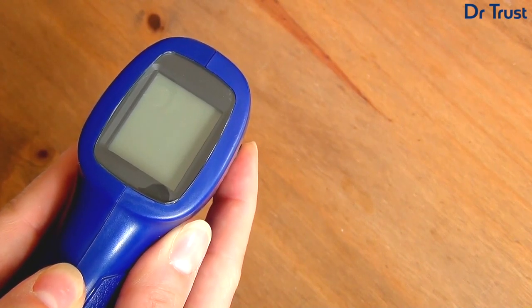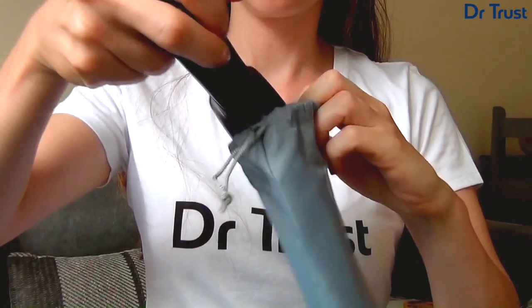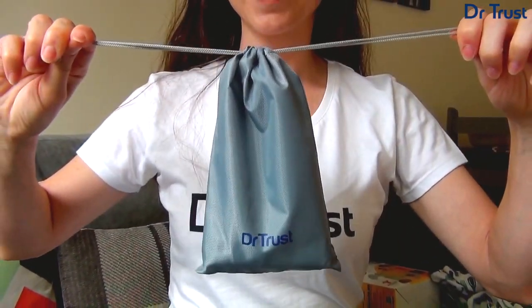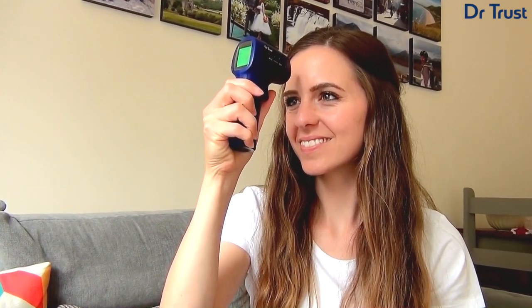Don't forget, the device will turn off automatically after 10 seconds to save energy. So don't fret about temperature tracking — make life easy with the Dr. Trust Non-Contact Infrared Thermometer Gun 610. Get yours today!